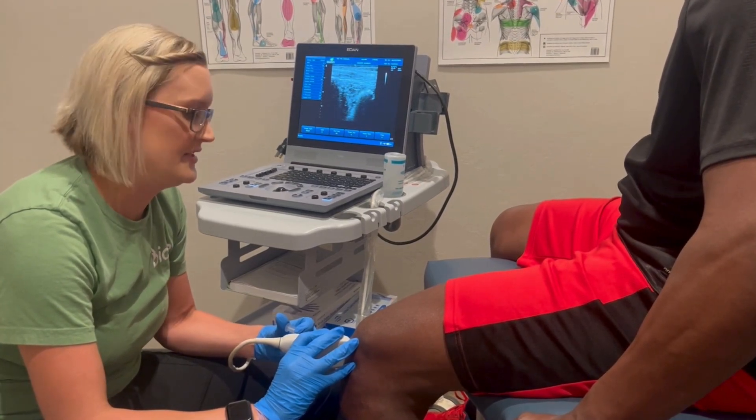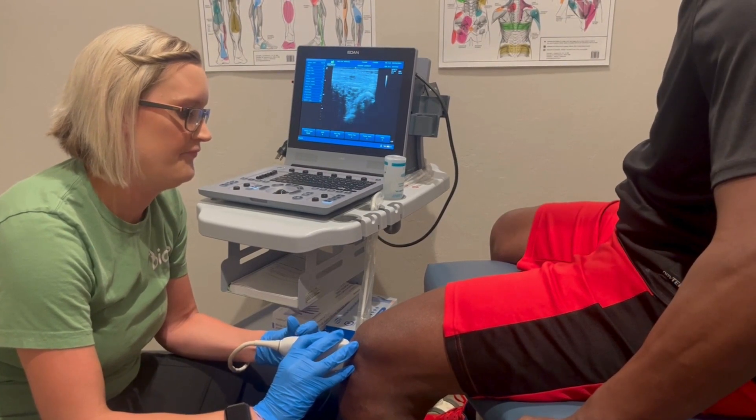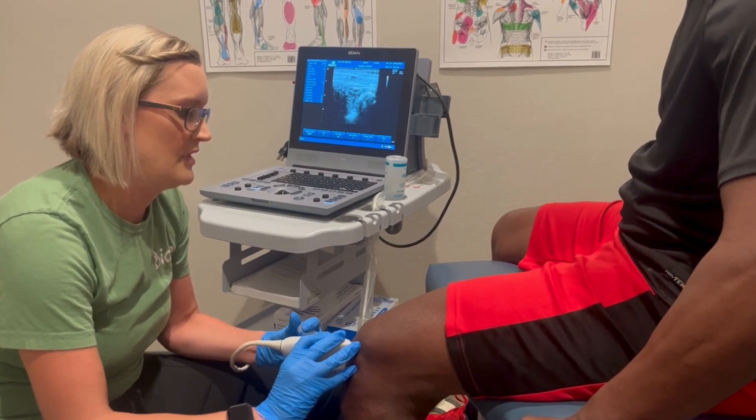Yeah, so now that's how you see them in the soft tissue space. Left knee's done.